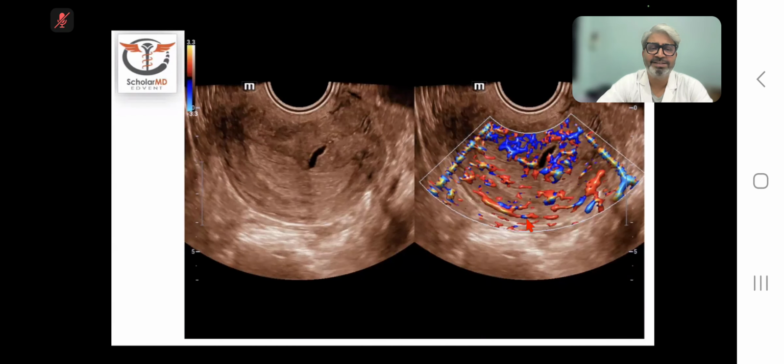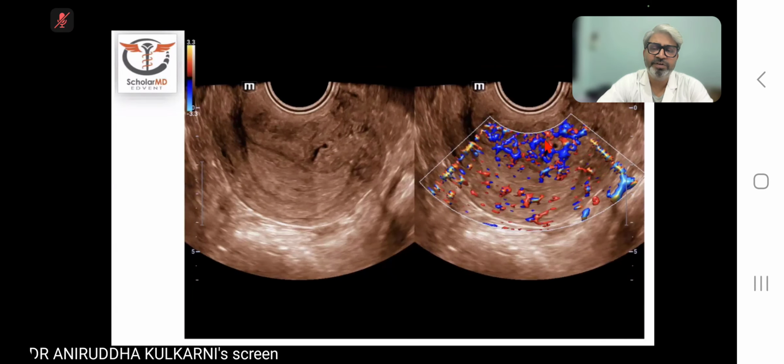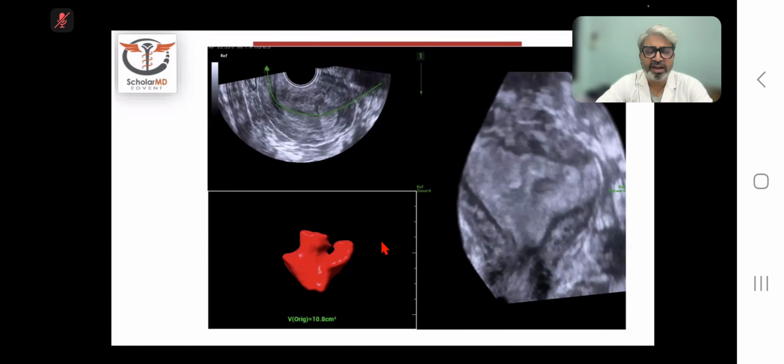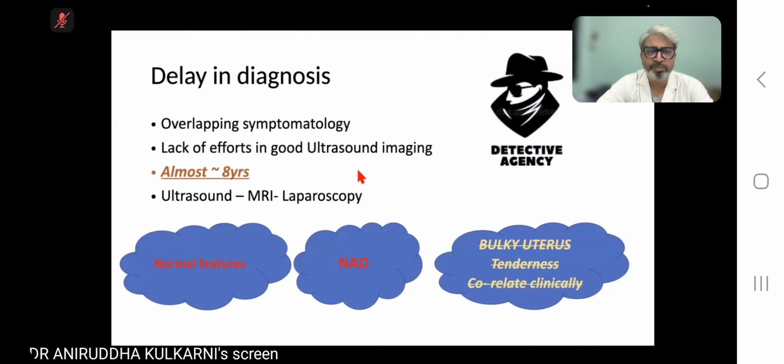Now, if you look at the color Doppler features, where you can take UMA, that is ultra microangiogram kind of flow in the uterus, you can see that it is taking a trans-lesional kind of flow feature in case of the adenomyotic lesion adjoining that. Now, if you reconstruct the endometrial cavity, here you can see the impression of uterine adhesions, which was nicely denoted on the 2D cine loop. It can also be seen on 3D acquisition of the data, very nicely on endometrial cavity assessment. So this is how you can see that these are endometrial adhesions apart from asymmetrical thickening of the endomyometrial junction.